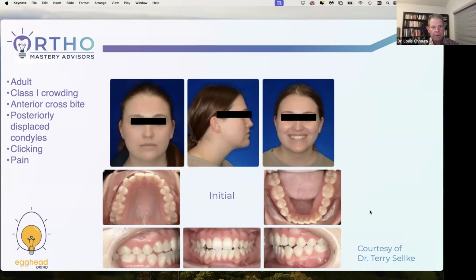You look at that upper left canine, there's the one tooth exception. That's going to take the longest, but all the other canines are rotated as well, right? But the upper left canine's the rate limiting step in this treatment. So can it be done? Yeah, but I don't know that I would do this as a first one. Or, I mean, remember, Dr.